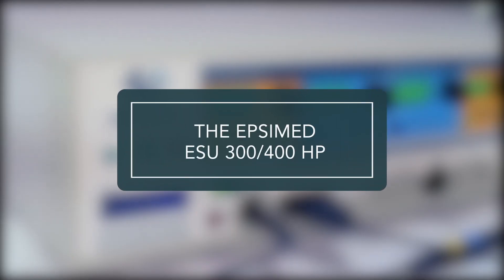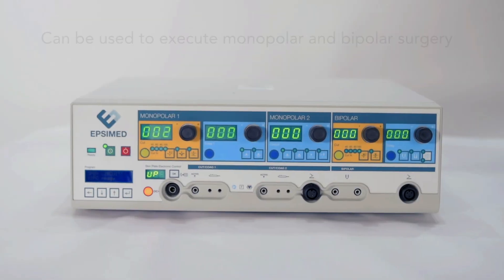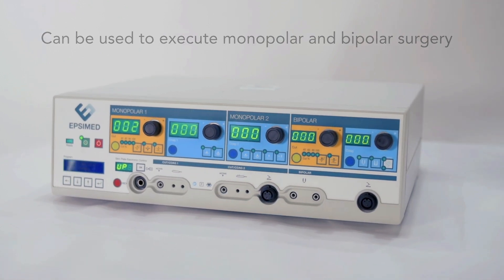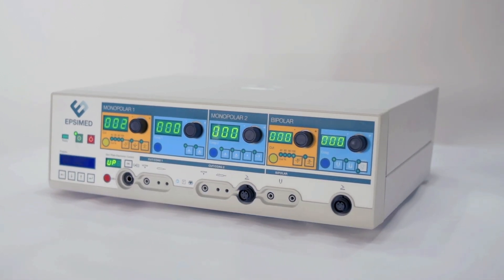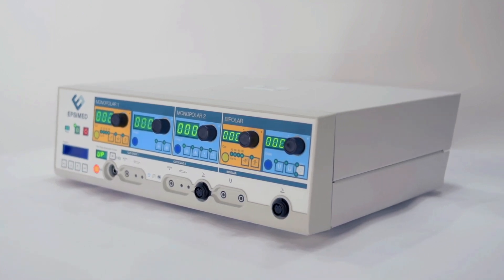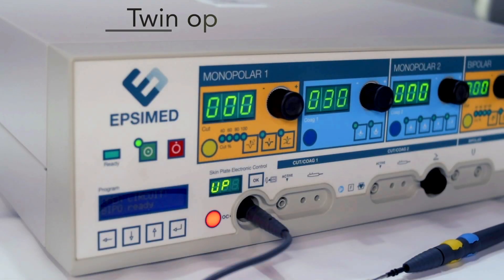The EpsiMed ESU 300 and 400 HP high frequency electrosurgical unit can be used to execute monopolar and bipolar surgery in the many fields of application where high precision and reliability is requested. Some of its main features include twin operative activity.